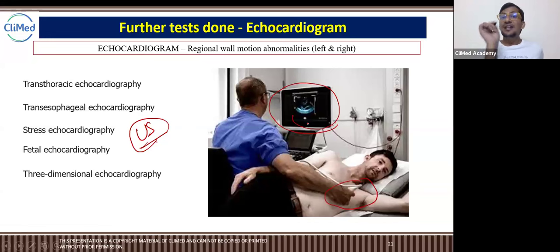This is not the real image of the heart, understand? Based on the ultrasound, it just creates an image. There is no camera inside the probe which shows the entire heart from the inside. Otherwise it would be showing the muscles, the red blood, everything. But no, this is just the sound. It captures the sound from the blood inside the heart, and based on that, it depicts the picture on the screen. It is completely ultrasound based.